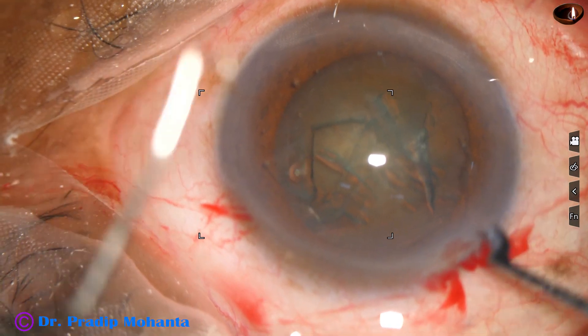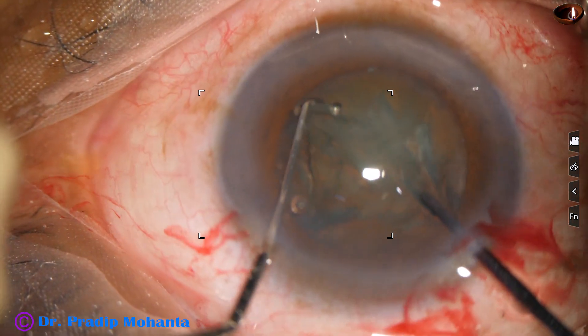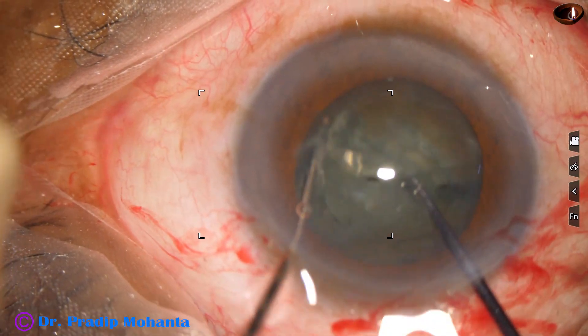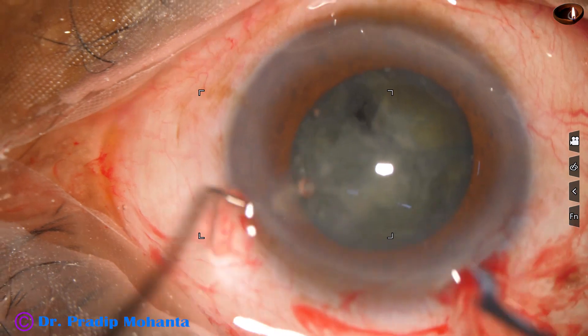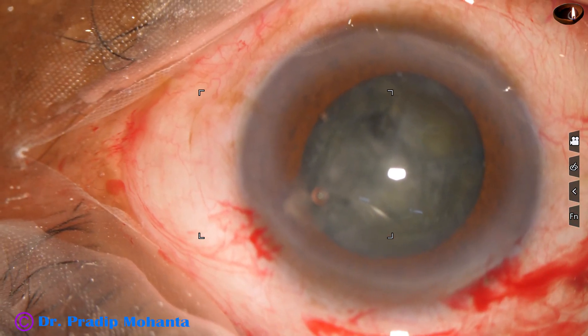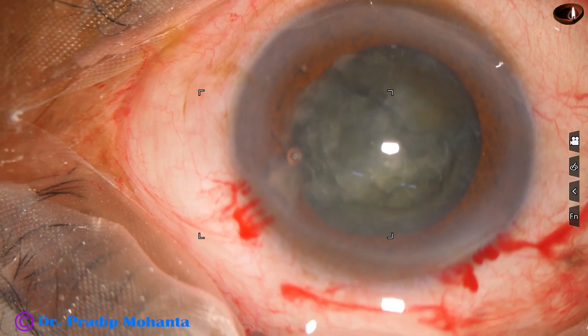Pre-chopper is introduced. The pre-chopper goes in; the sustainer supports the other side of the equator and we divide the nucleus into some parts. In this case, the nucleus has been divided into 3 parts — 3 fragments on one hemi-nucleus. The other hemi-nucleus has been divided into 2 fragments.